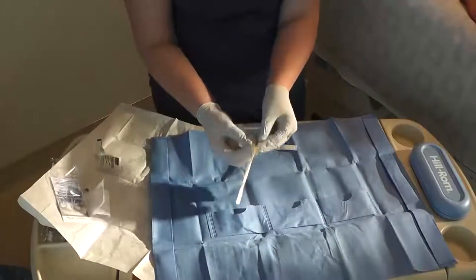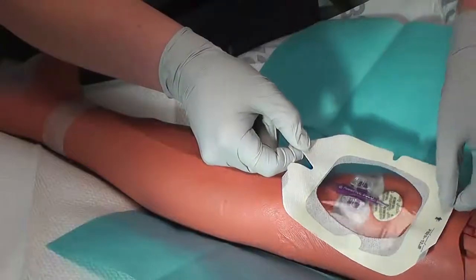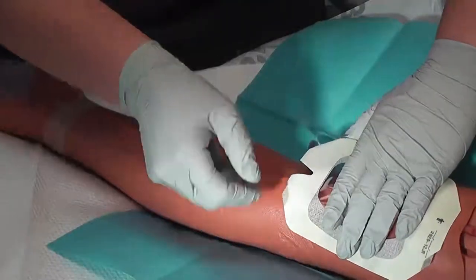Apply the dressing to the line, covering the insertion site and the wings. Then apply the securing tab under the lumens to completely close the dressing.